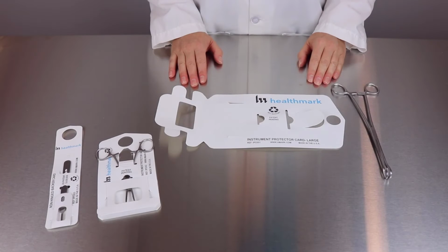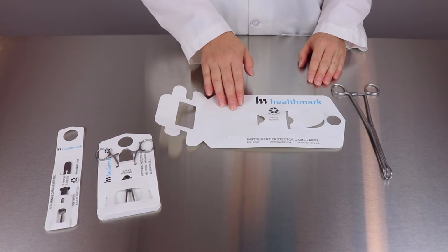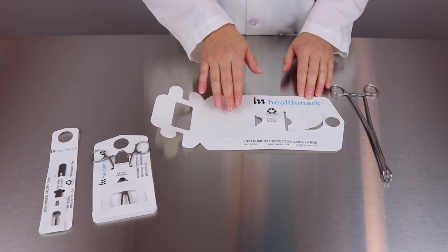Today I'm going to show you how to assemble the Healthmark instrument protector card. As you can see, we have small, medium, and large sizes. So today I'm going to show you how to assemble the large size.